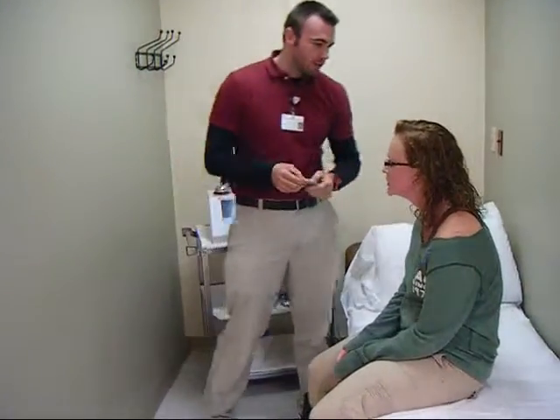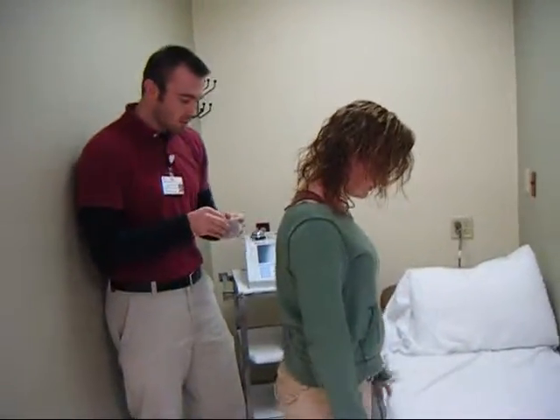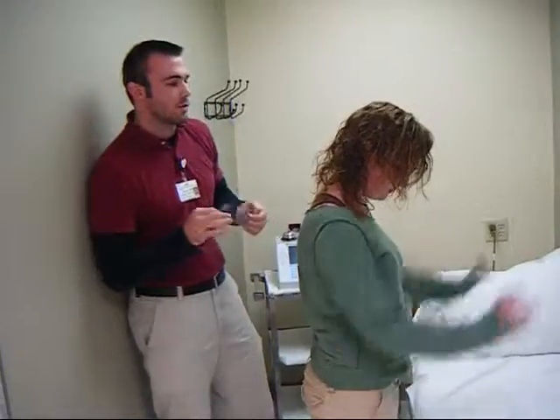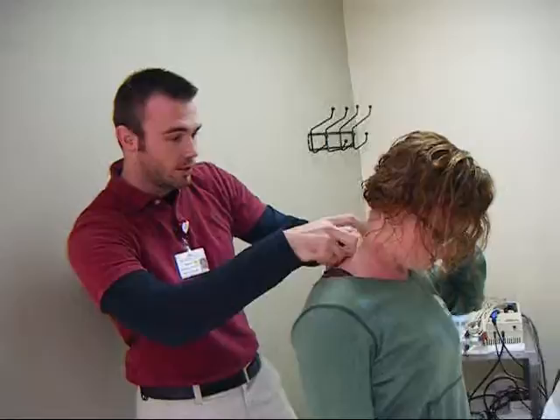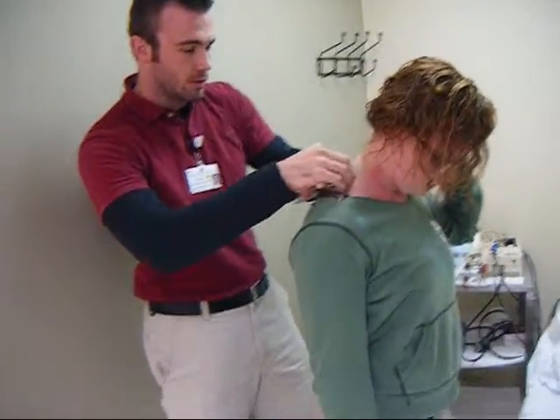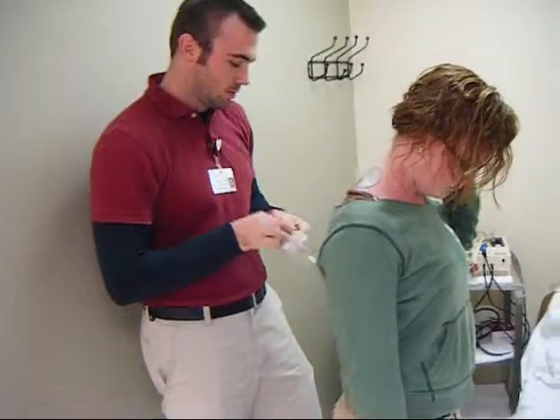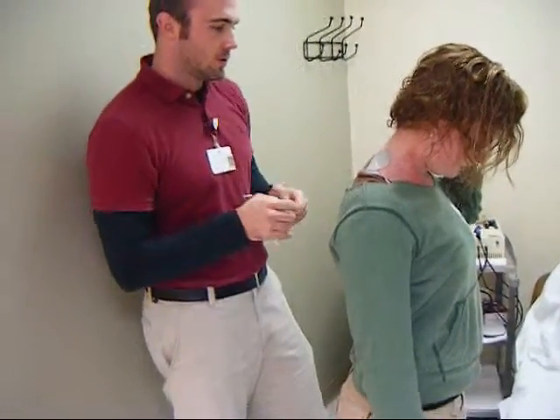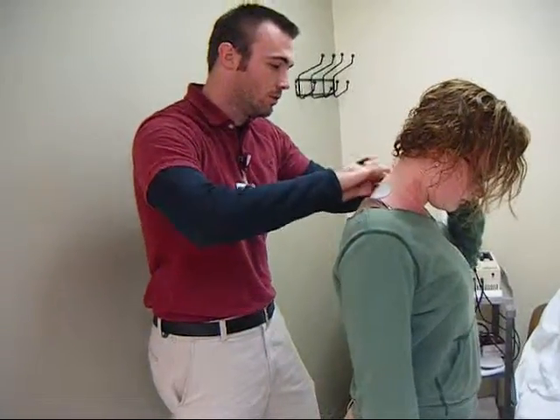So what we're going to do is I'm going to have you stand up for me real quick — face that wall. Can you push your hair off to the side? Thank you. So we're going to get right here. The big thing is we don't want it touching your spine, so we're going to get right there in your upper trap. There we go. I'll get the other one right here.